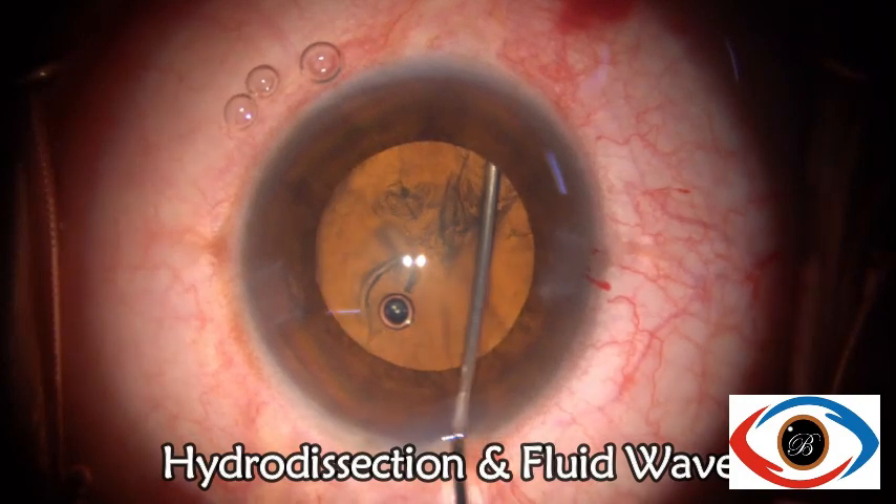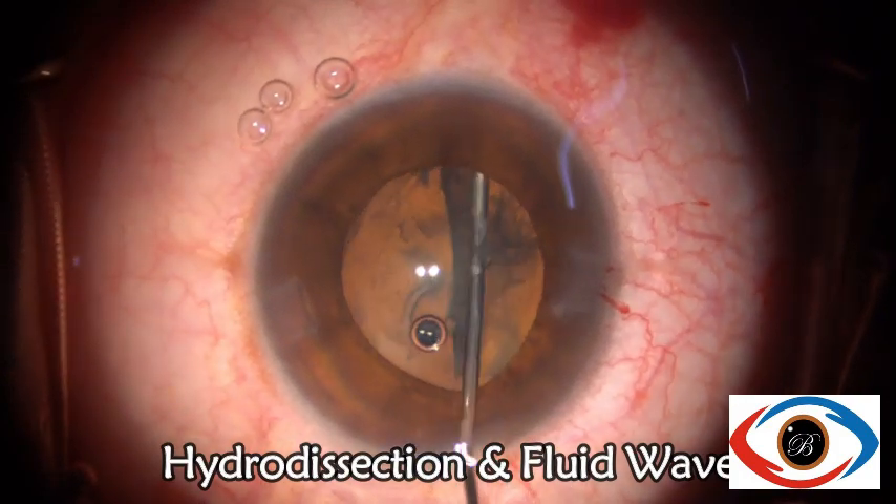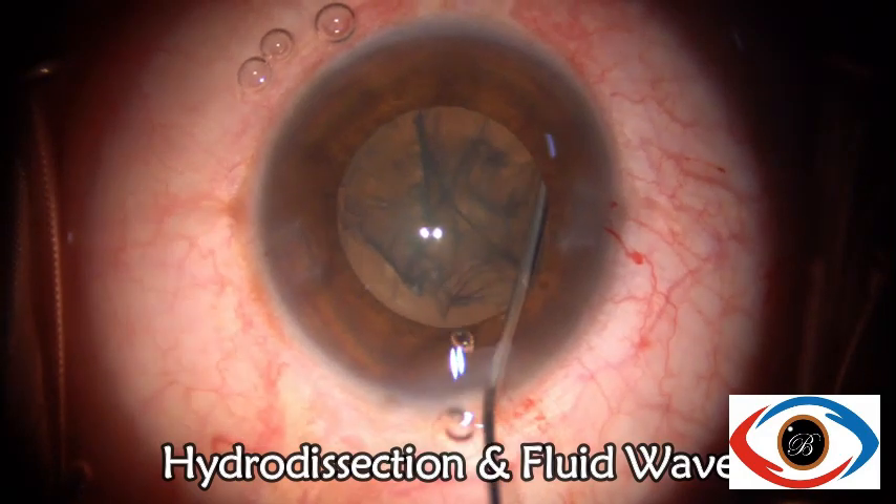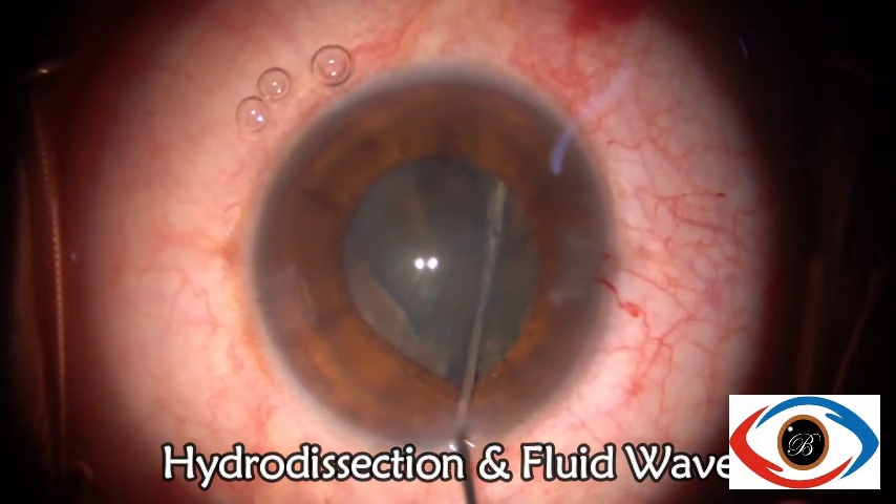While performing hydrodissection, we can see that there is no zonular weakness even though the anterior zonules have been sheared during rhexis formation.